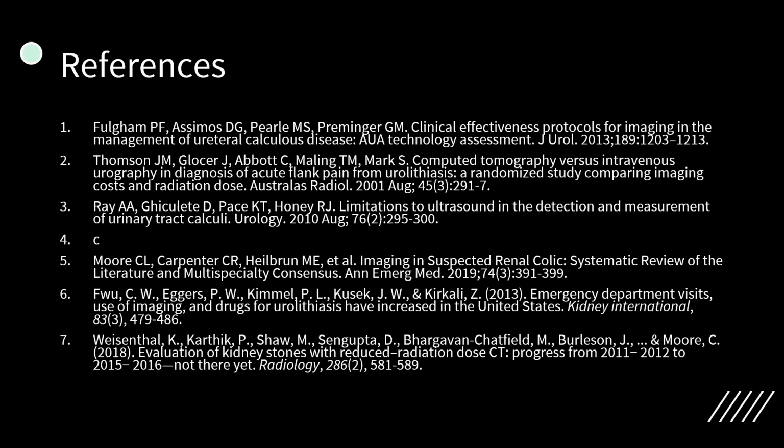I guess the challenge comes in when the young patient comes in at 12:30 at night. We could have access to CT, but it's probably not emergent if their pain's under control in the emerge. Do we hold those patients overnight to get their CT? Do we send them home to get an outpatient CT? It might be just an outpatient ultrasound, right? If it's something we're thinking.